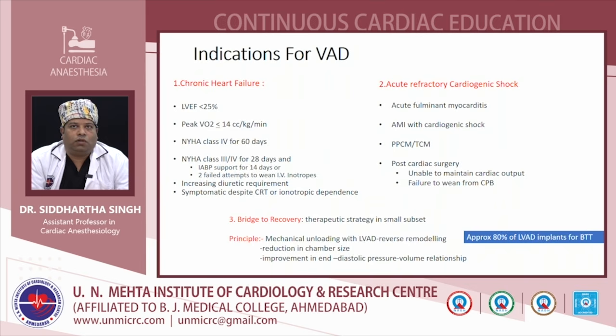This is the most common cause, acute myocardial infarction, for requirement of ventricular assist device, and also postpartum cardiomyopathy or tachycardia-induced cardiomyopathy, post cardiac surgery inability to maintain cardiac output, and failure to wean from cardiopulmonary bypass. So these are the indications.